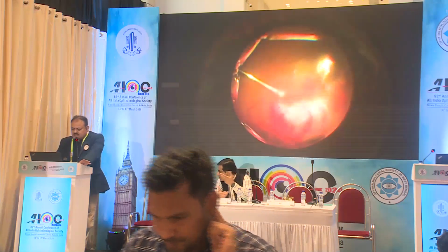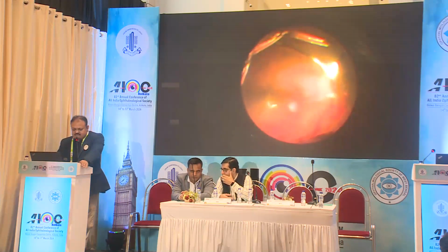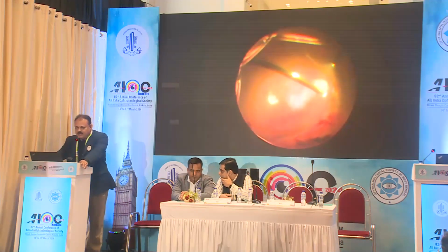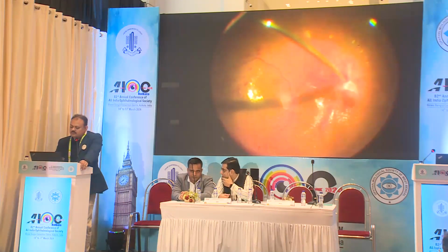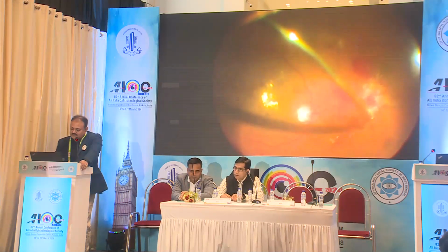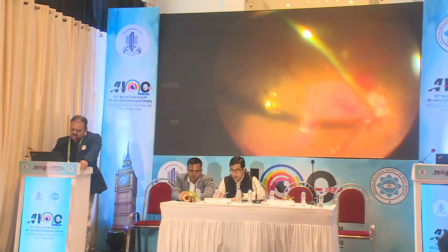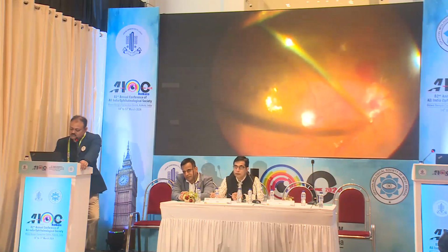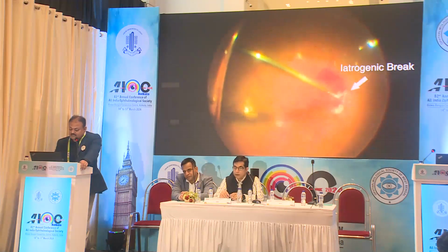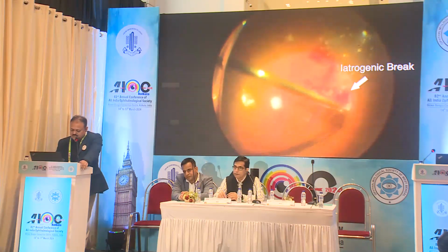So this was a vitreous hemorrhage with TRD. Nasal TRDs at times are very bad. It's very difficult to take out with the cutter. The only option is a bimanual approach, which should be tried. This retinal membrane was mainly not taken up by the cutter, and then we used the forceps.